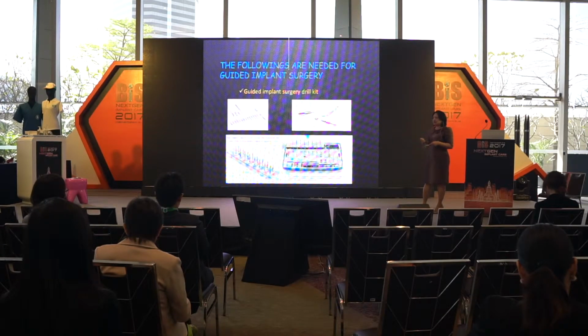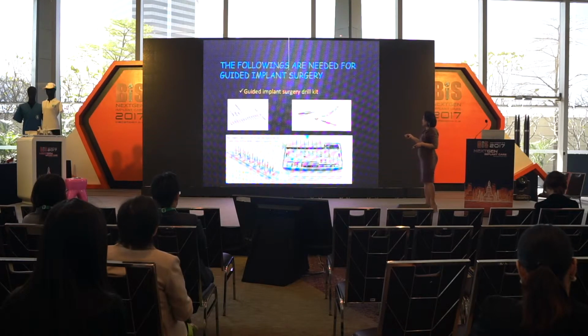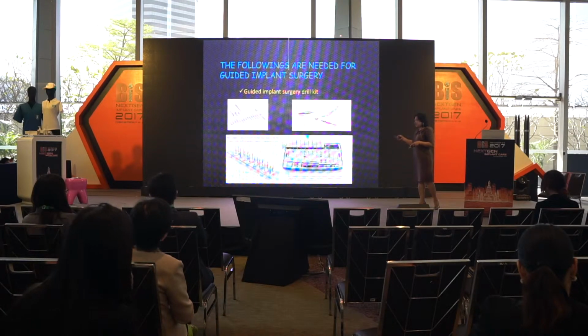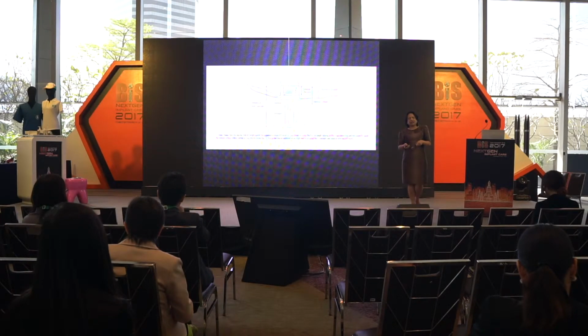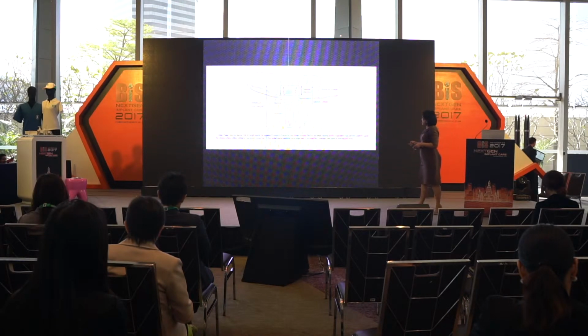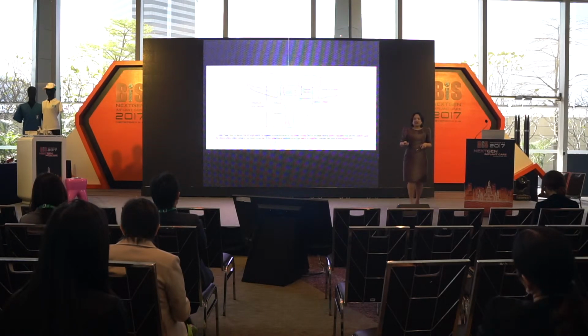You need to know that the brand provides the guided implant surgical kit. Even this one is like a mini drill, also the drill with a hole, or with the sleeve, they have a tube. What is different is that we call it the longer drill. Why is the drill longer? Because we need to compensate for the sleeve platform and the implant, and the sleeve height also. That's why the drill is longer.